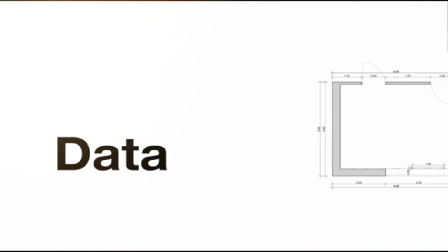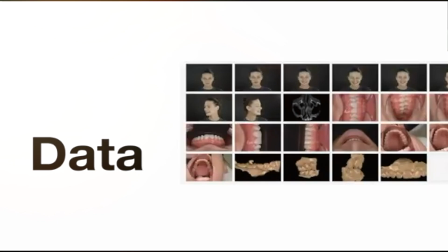So what they normally do in architecture, first they start with data, okay? So, which means pictures, measurements, the basic things. And for us, the same thing happens in a consultation, where we see the patient and we get a number of files and file formats that will give us the information required for planning. For example, on portraits, we have the relationship with the face. On CBCT, we see the bone availability. On scans is the canvas on which we plan. On videos, we see the lip position and all of these things.